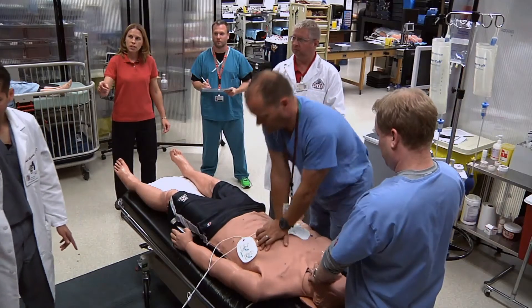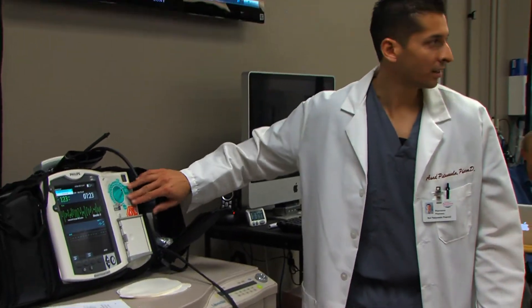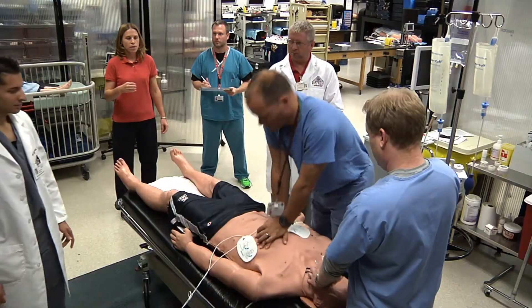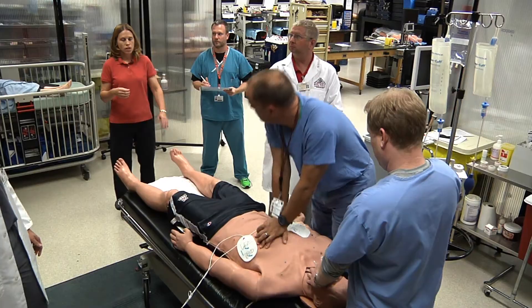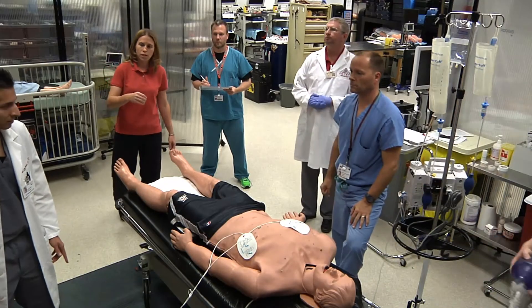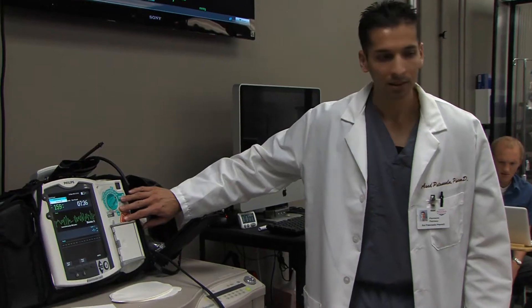Can you charge the defibrillator to 200 joules? Charging defibrillator. We will defibrillate on my word. It's important to minimize the interruption in chest compressions, so let's go ahead and clear the patient. I'm clear, you're clear, we're all clear. Defibrillate now. Shock delivered.